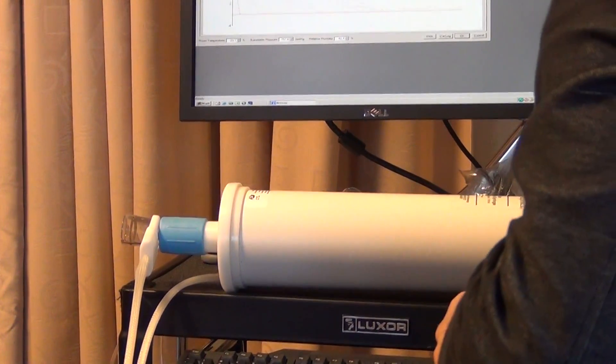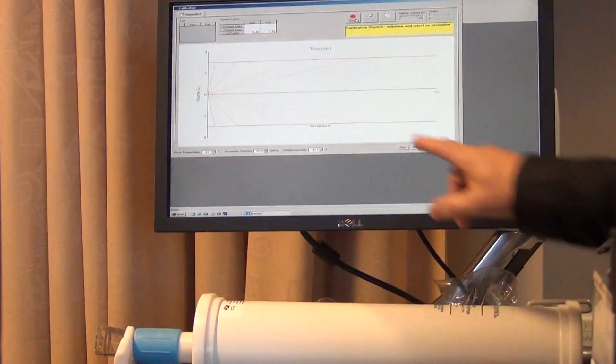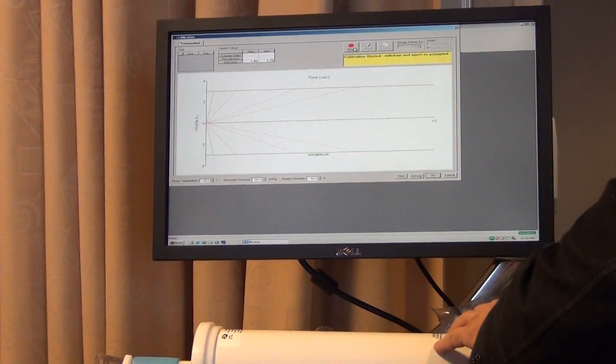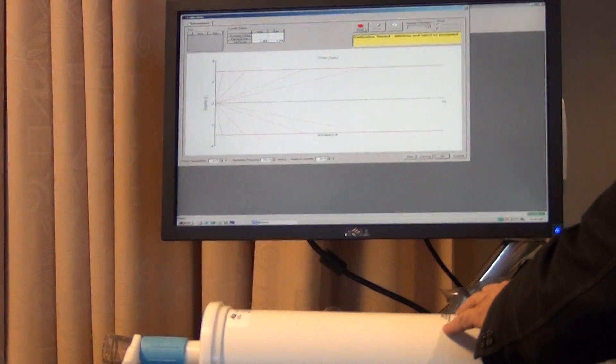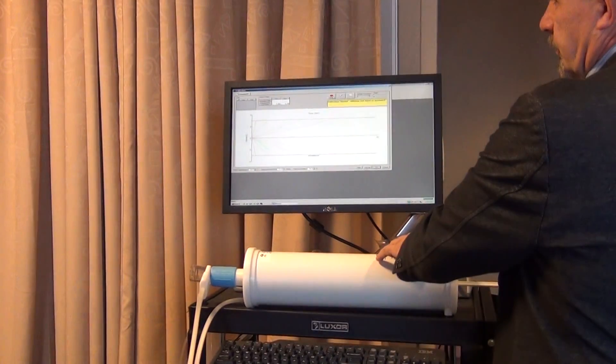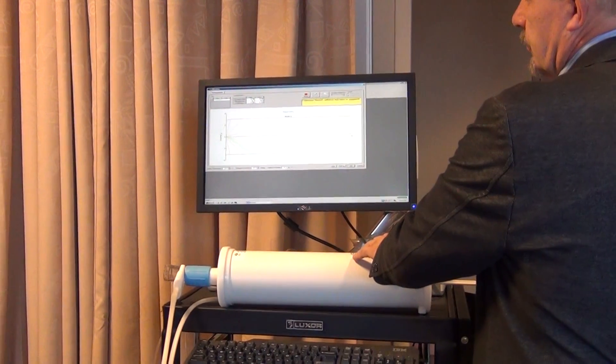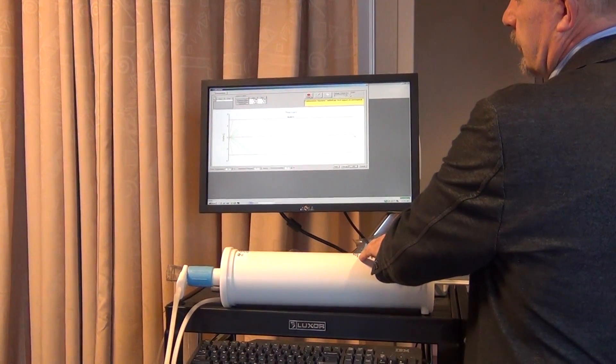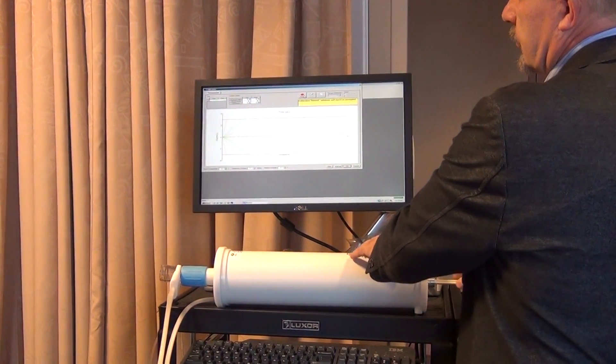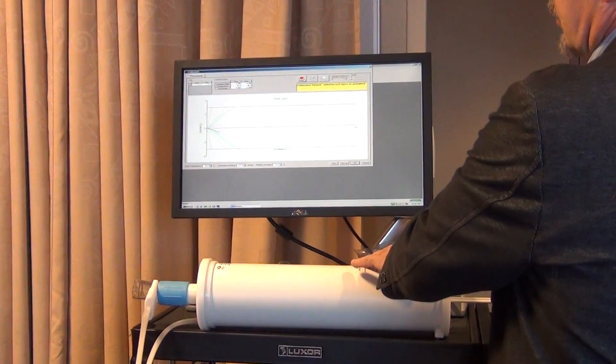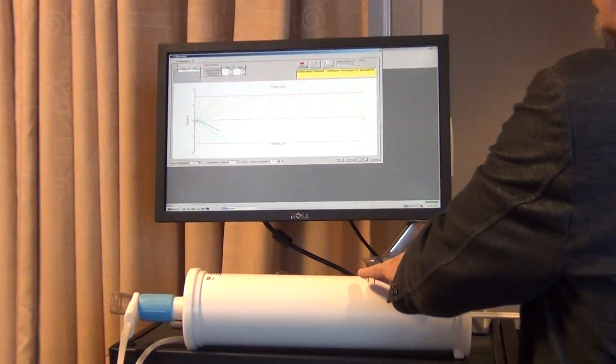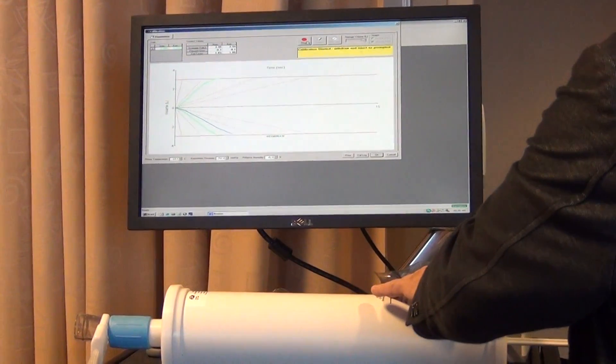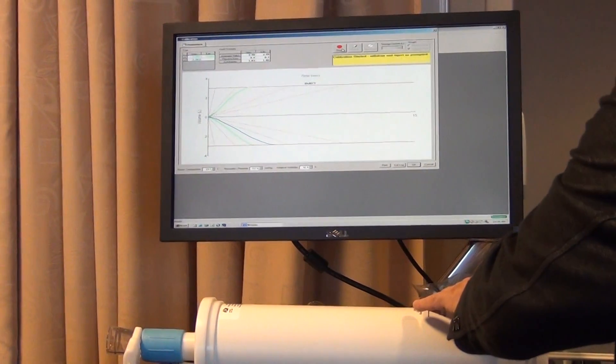Then you press the start button to begin calibration. You have to withdraw first, and then inject the full three liters. You have to do this five times with different flow rates, and you can see that by the different lines on the graph.